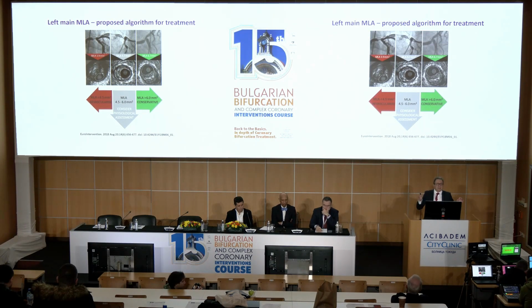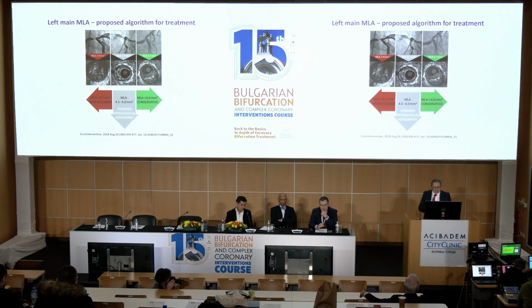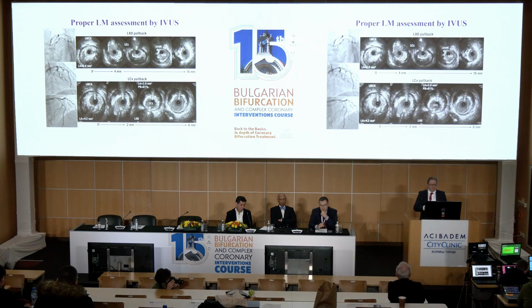So you should keep in your mind this very simple cartoon showing that this is not a matter of 6 square millimeters being a cutoff, yes or no, for intervention. We should remember that we have a kind of gray zone between 4.5 and 6 square millimeters for left main, where if we don't have clinical symptoms, if we don't have a very strong confirmation by non-invasive techniques, invasive functional assessment is necessary. It was done today very properly.